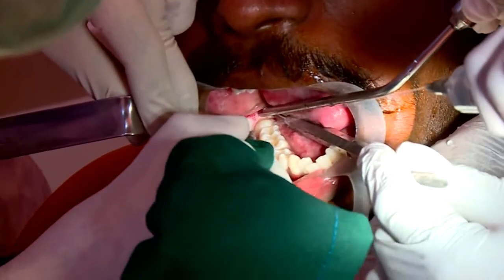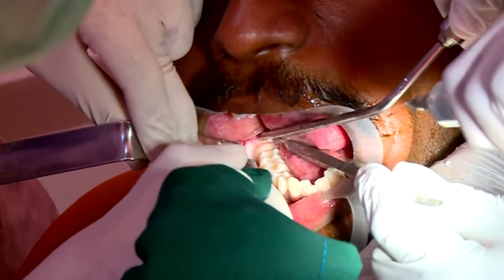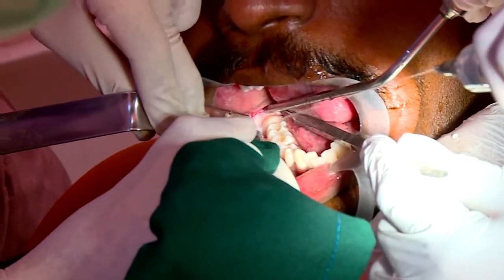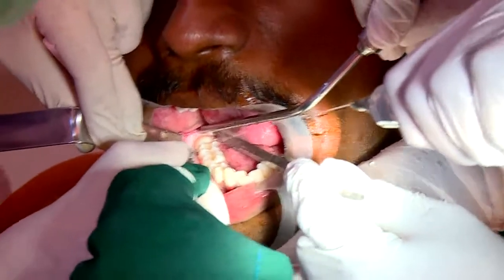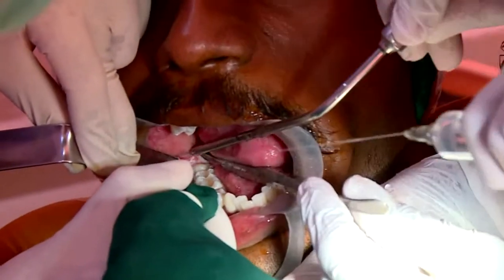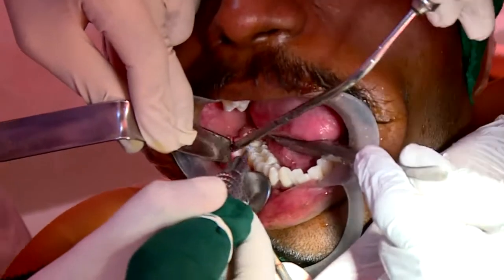Once you enter the marrow stage, you will start feeling bleeding. You can either run the handpiece in a continuous motion, or you can put certain holes like postage stamps.